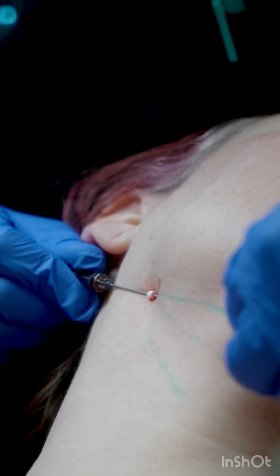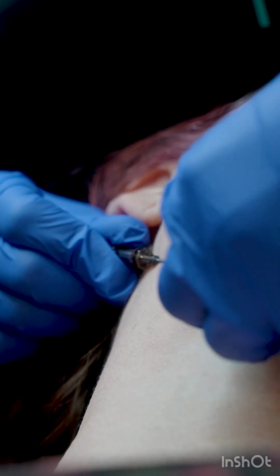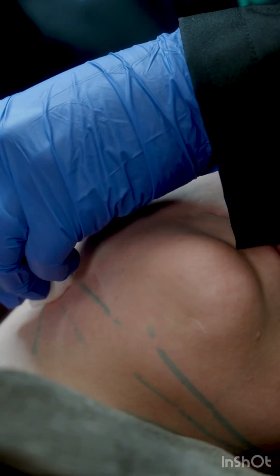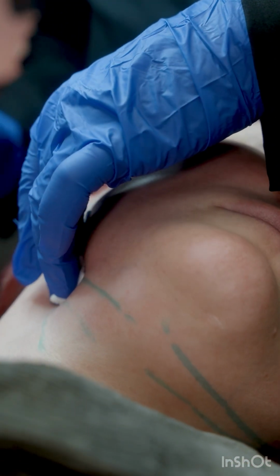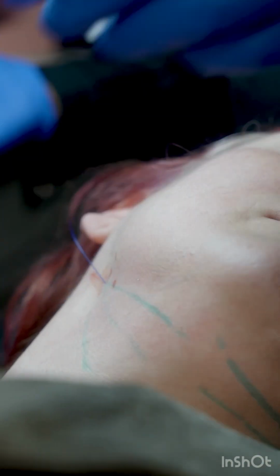As you can see, numbing prior to starting inserting the PDO threads has caused her much comfort, and it makes the procedure very tolerable. Once I insert the thread, I twist from right to left and pull out the cannula, and the thread is left in place.